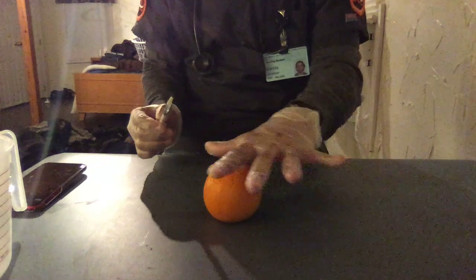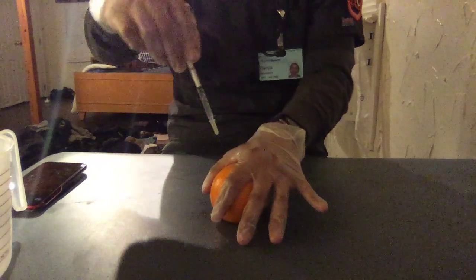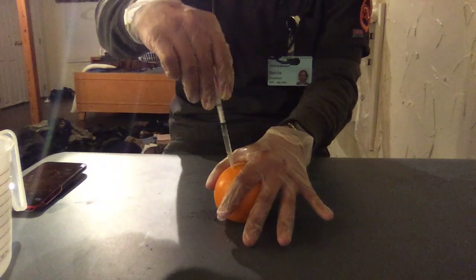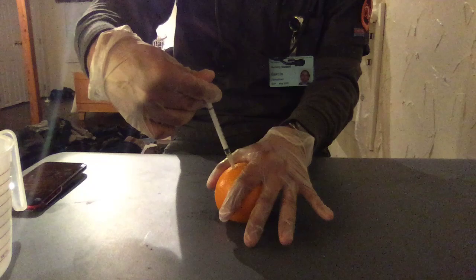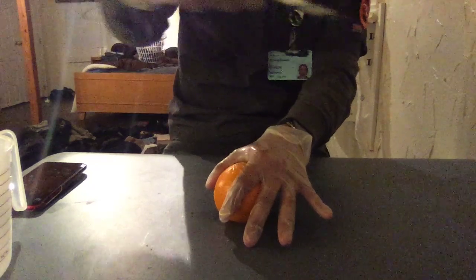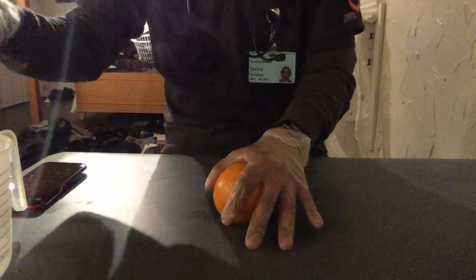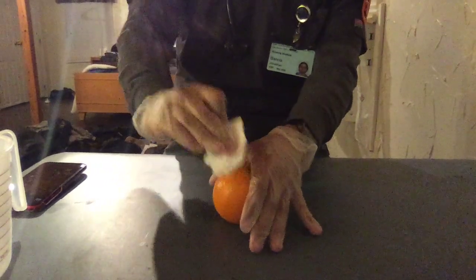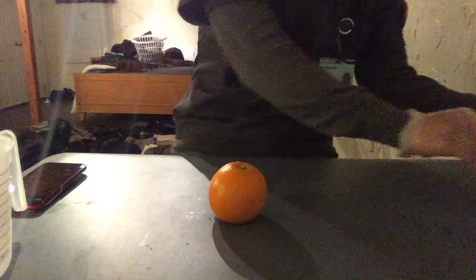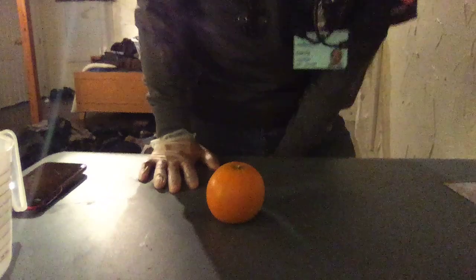So I will go 2 inches away. I will pinch it a little bit between my index and my thumb, going in at a 90-degree angle. Administer all the medication, and then pull it out nice and slow. Activate the security features on your needle, and then throw it into the sharps container. And then again, don't massage. You just pat. If it's bleeding a little bit, you could always use this again. So that was for the subq, and then I document everything correctly.